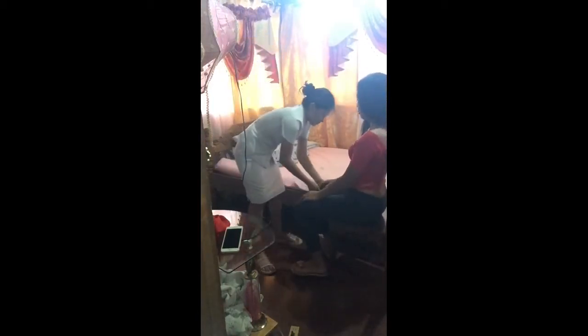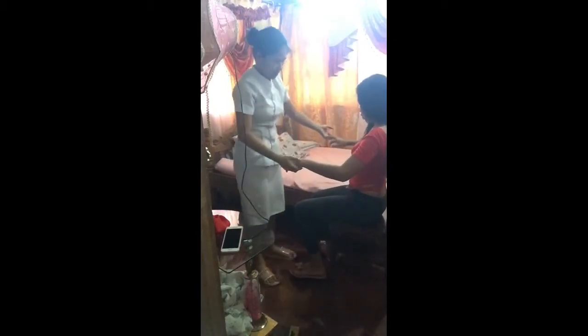Ipatong iyahang tiil sa wheelchair. Ipatong iyang tiil sa wheelchair and iyahang kamot ibutang sa arm sa wheelchair. With the help of the belt, move the client inward to the chair. Lock the wheels.